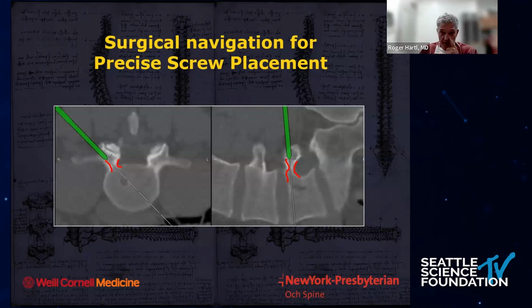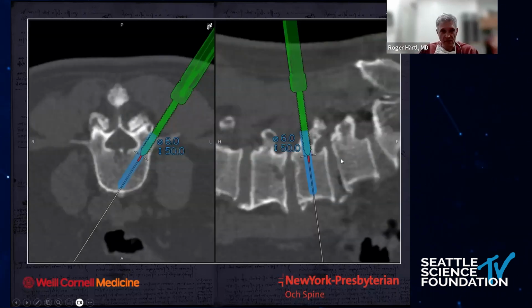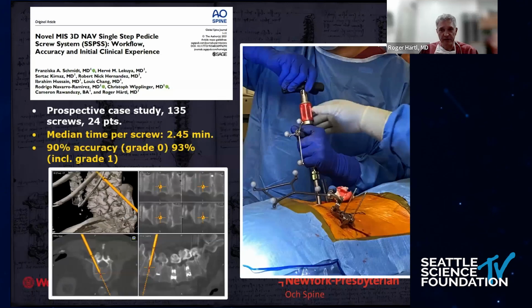And in this case, because the pedicle was so small and corticated, we used a navigated awl-tip and then put in the screw later. So I'm a big fan of navigation, but I really make sure that I always get tactile feedback. And I think it's also good for the residents and fellows so they can correlate what they feel with their fingers and what they see on the screen.